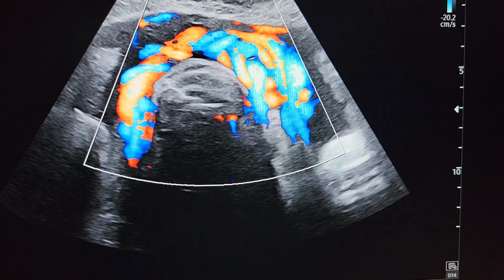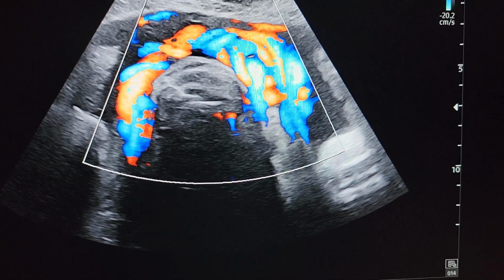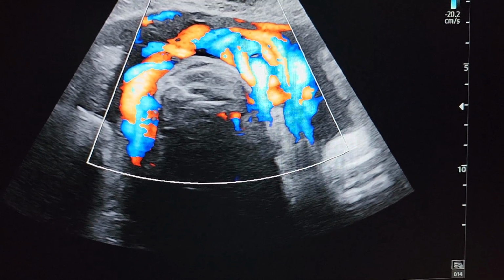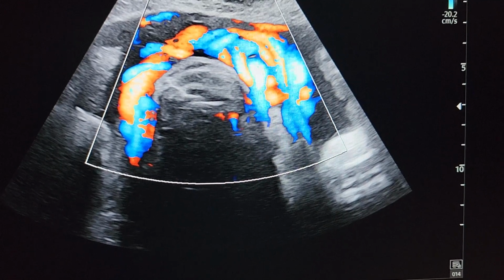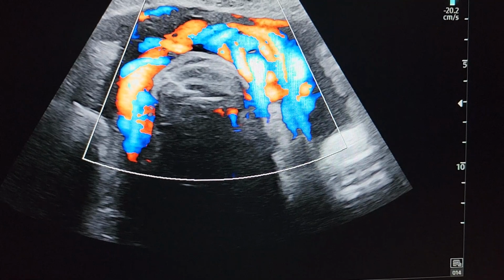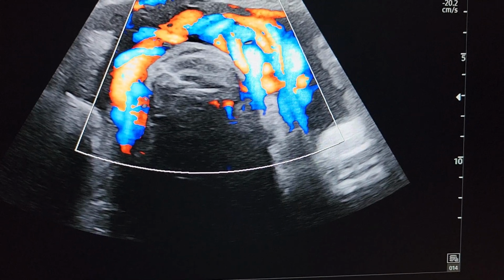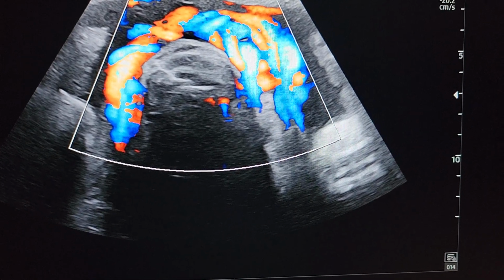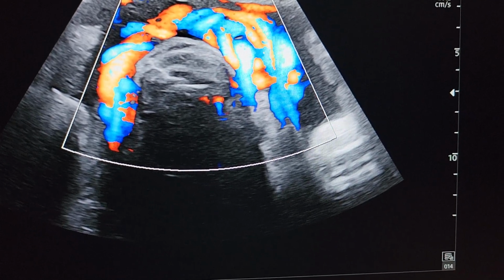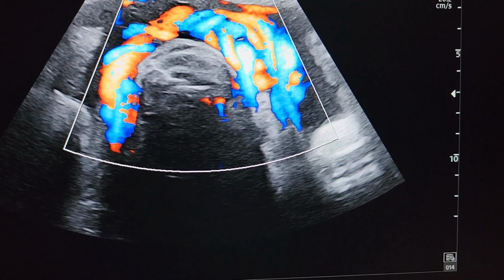This is a very simple and short video for beginners and students on how to detect nuchal cord, or cord around the neck, in a fetus. What prompted me to do this video was one of the obstetricians called me and said that there was a scan done where the report said two loops of tight nuchal cord. There were other indications for intervention and a C-section was done not for the nuchal cord but for other indications. And the time between the scan and the C-section was very little.